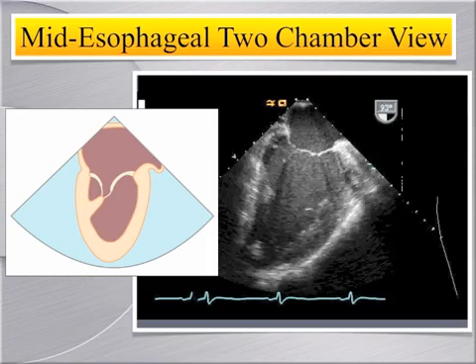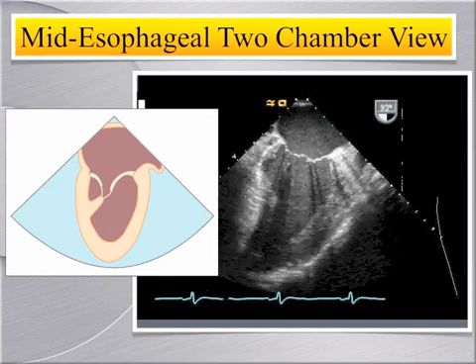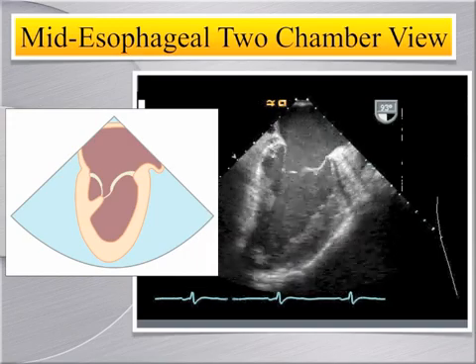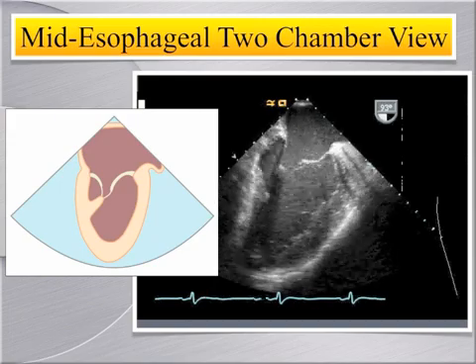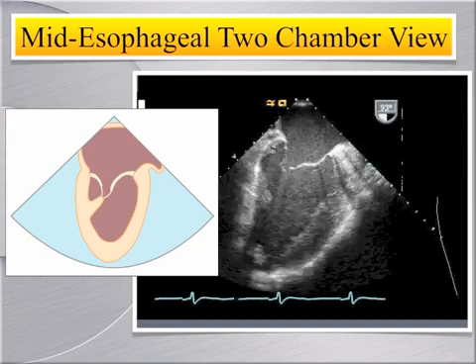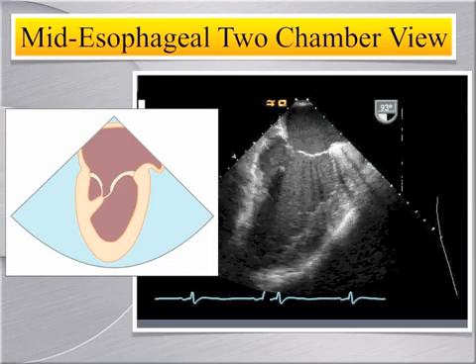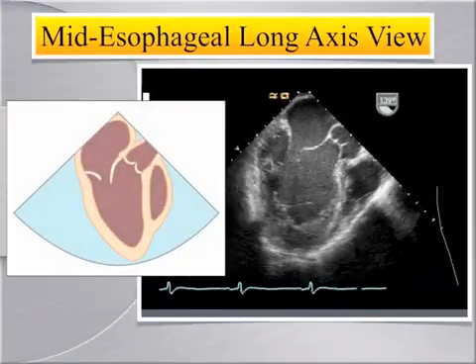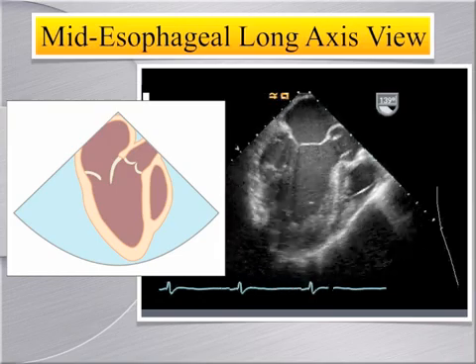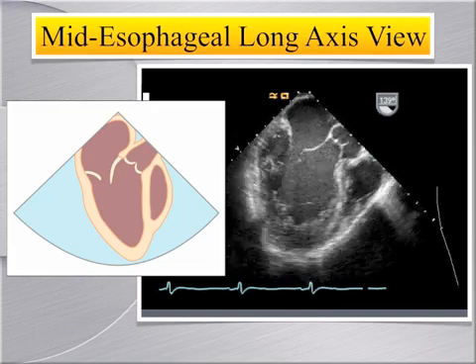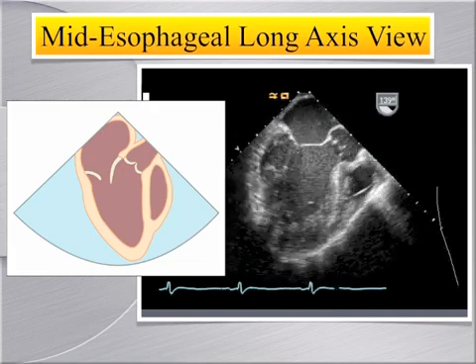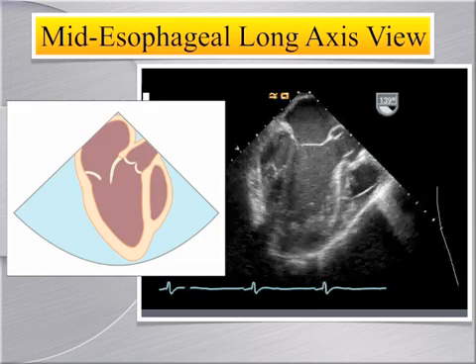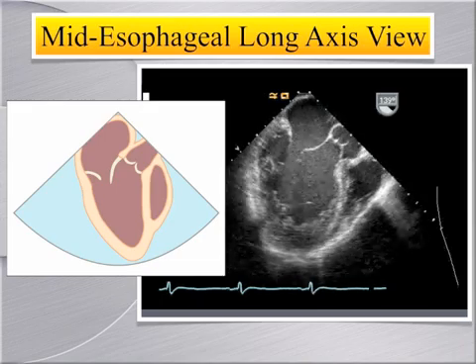At 90 degrees, the mid-esophageal two-chamber view shows the anterior wall on the right and the inferior wall on the left of the LV at the basal, mid, and apical levels. Note that apical foreshortening is a common issue in TEE, and thus the probe should be gently retroflexed to assure adequate apical visualization. At 100 to 120 degrees in the mid-esophagus, the mid-esophageal aortic valve long axis view shows the anterior septal wall to the right and the inferolateral wall to the left. It also shows the left ventricular outflow tract for measuring its diameter to calculate stroke volume and cardiac output.